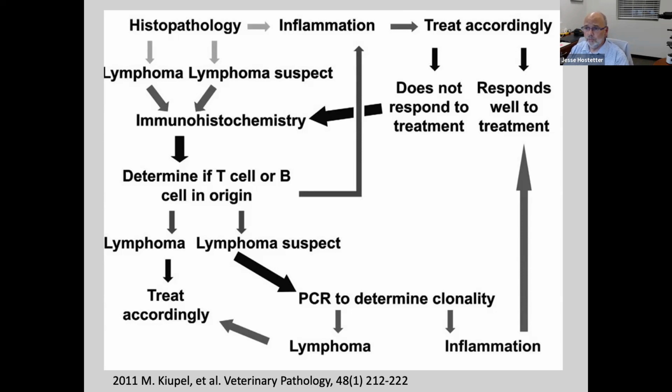So I'm a little bit behind in my literature, but in cats, I think there is evidence, yes, that Helicobacter is associated with deep penetration into the glands and lymphocytic infiltrates, and then lymphofollicular hyperplasia. That can be a picture associated with gastritis associated with Helicobacter.